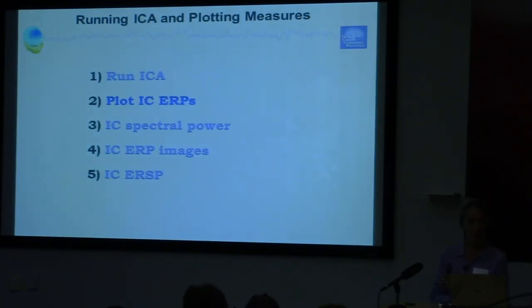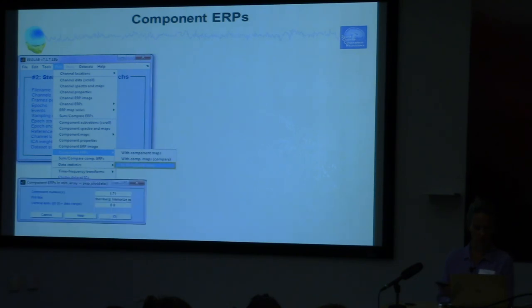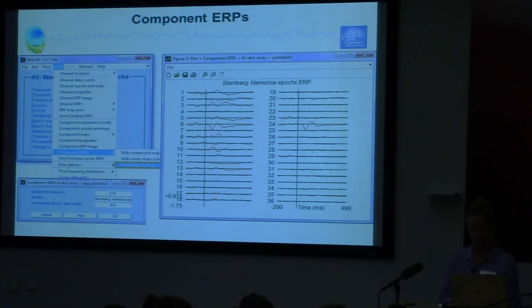Now I'll go through different plotting options for ICA components. For component ERPs, the simplest way is to look at them in the rectangular array. You can choose all the components and very quickly see what ERPs look like for all the different components, and you might be able to find something interesting at a glance.